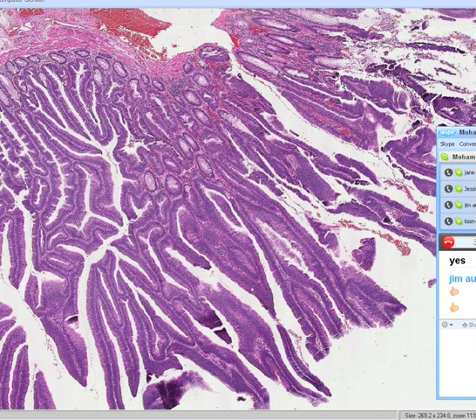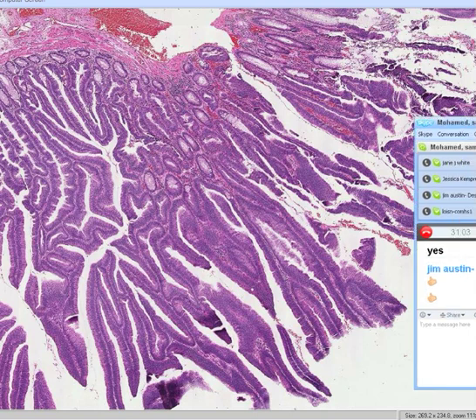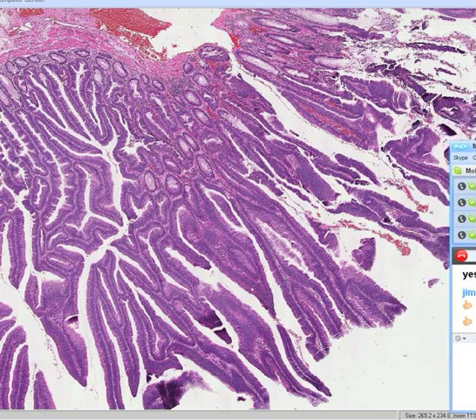So ladies and gentlemen, does anybody want to take a real guess as to what this is? I'll accept all stupid answers and theories, even my own. But remember, I've already used the word villus on here, and I said it was a proliferation of the mucosa, didn't I? So what is this? Come on, anybody speak up. And I'll give you an A for today. Carolyn is going to make, well, in a way, you know what?